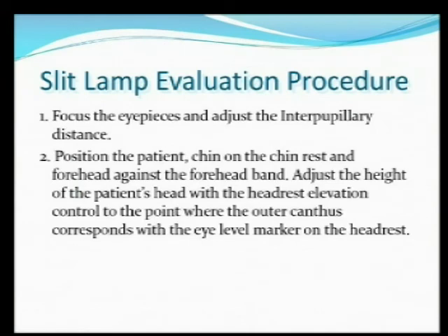Okay, so now we know the capabilities, we know the types of illumination. Now what we're going to get into is a step-by-step procedure, and this will be a procedure that we'll be working through this weekend as well. If you get the habit and you understand the procedure, the goal is that you can go back to your office and practice some of these procedures and get better at it. Even though you may have your own little routine that you use now for the slit lamp, try this. Some of it's the same as what I'm sure you're doing, but other things in here might make it a little bit easier to pick up some of these conditions.